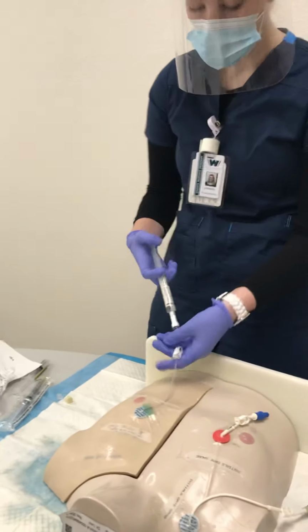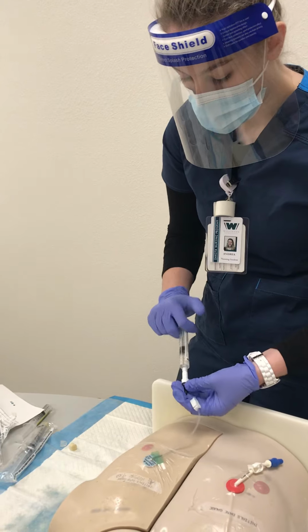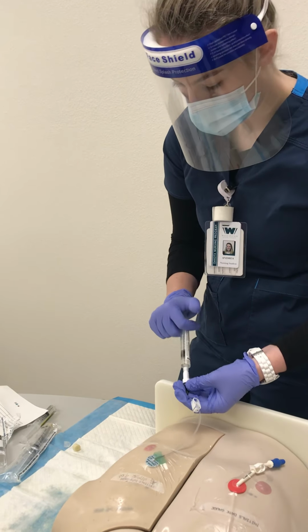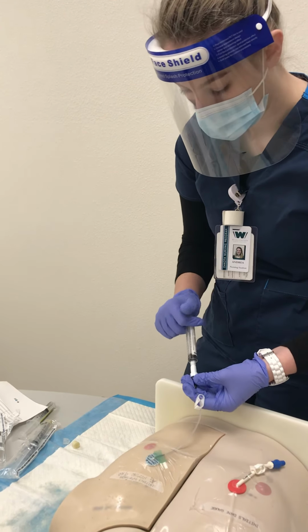Now ceftriaxone we need to administer about 2 to 3 minutes. So a slower administration, but for video purposes, we're just going to do the push-pause method until it's all into the patient. But 2 to 3 minutes is about how long we'd want to administer it.